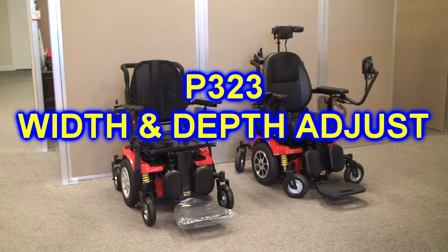We've had several people ask what it takes to change the width and the depth on the Vector. The R-Net and the VR2 version both use the same power base and the same seat, so changing either one of them is identical.